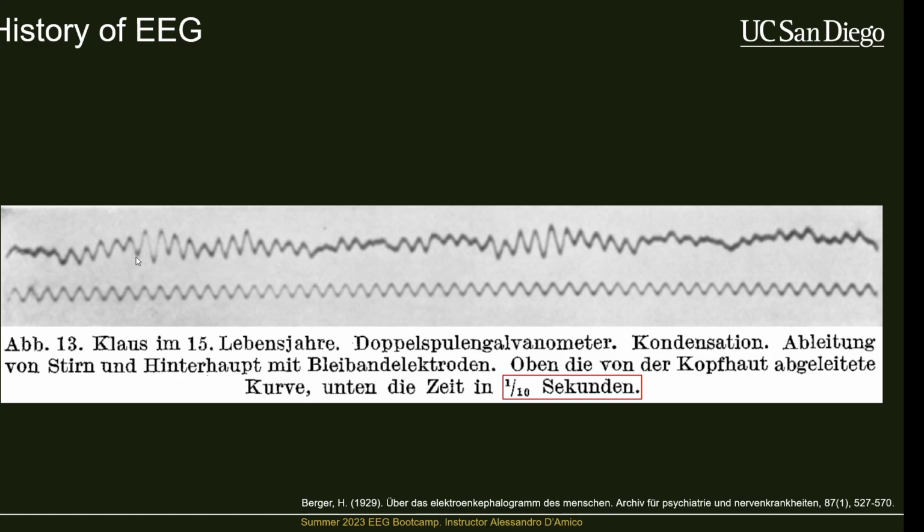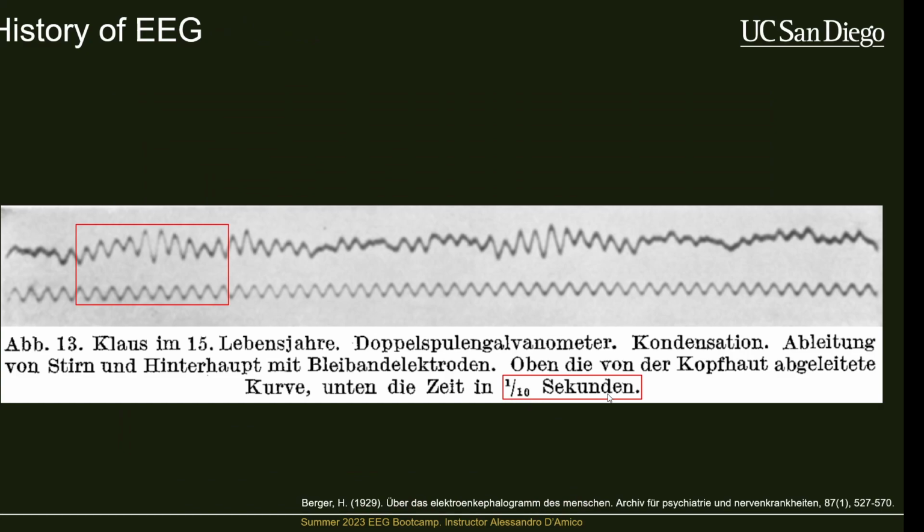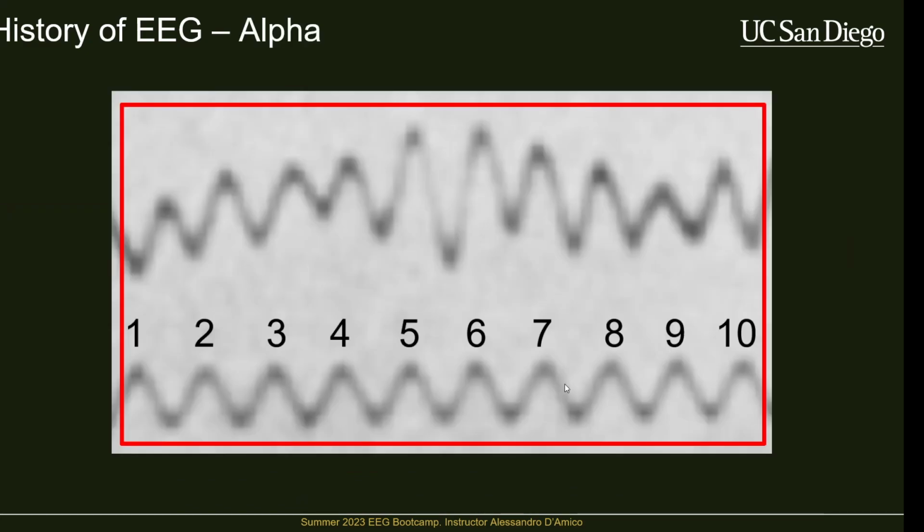And if we look pretty carefully, it looks eerily similar to the underlying wave. And if we zoom into a portion of that, we have our sinusoid 10 hertz oscillation, and we can actually physically count all 10 of the peaks, right? So this is a 1 second period, and I know that it's a 1 second period because I see 10 bumps in it, right? Because he said the oscillation of the sine wave is one peak every 1/10 of a second.